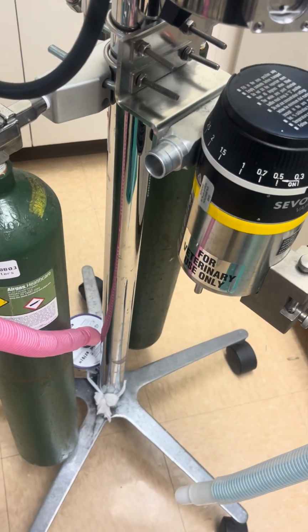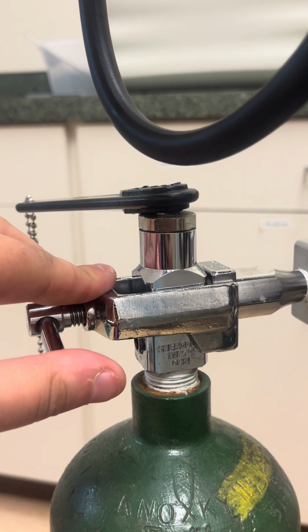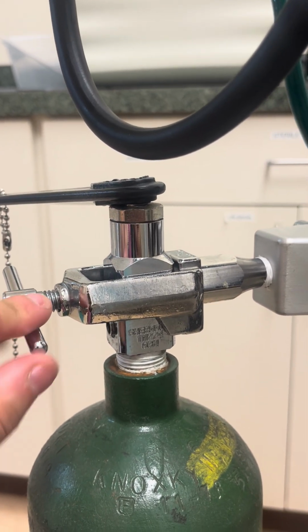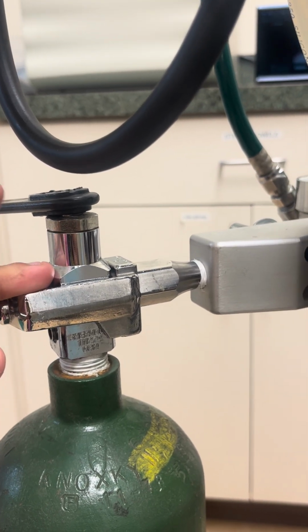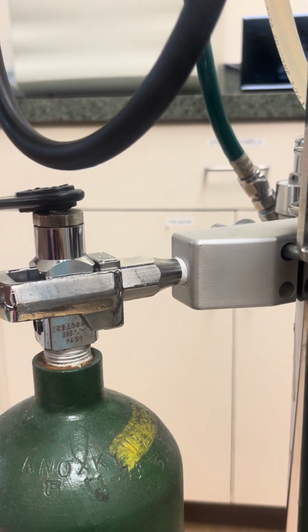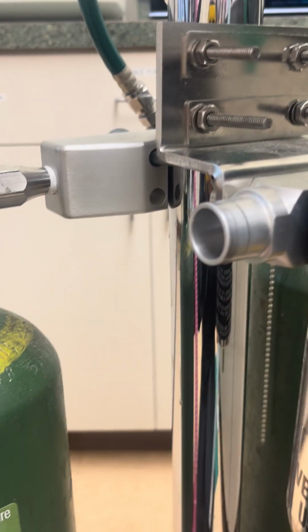And then our second step is the yoke. That is this part right here. It attaches the oxygen tank to the anesthesia machine. It has two holes and a pin index. The black piece on top opens the oxygen tank, and this is to ensure that the correct cylinder is attached to the O2.